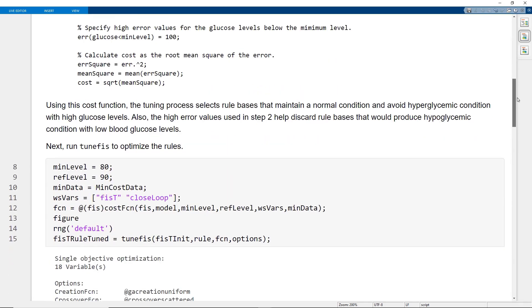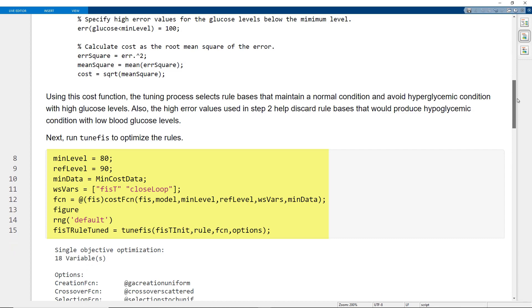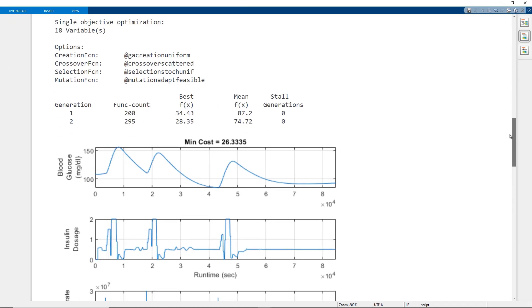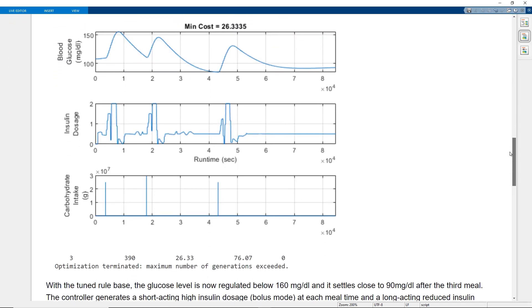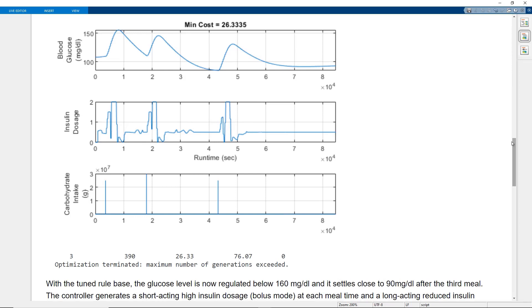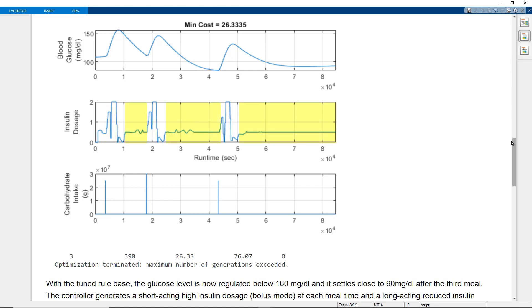Next, run tunefis function to optimize the rules. This plot shows the optimization results with the tuned rule base. The glucose level is now regulated below 160 mg per deciliter and it settles close to 90 mg per deciliter after the third meal. The controller generates a short-acting high insulin dose at each mealtime and a long-acting reduced insulin dose during the fasting period.